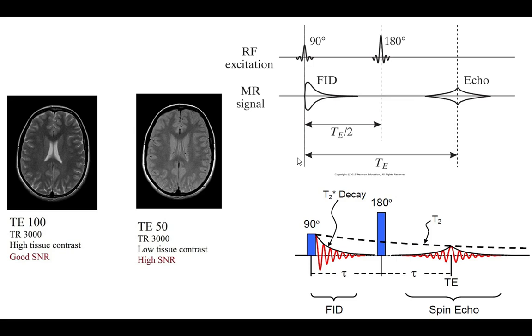What do you want? You just have to understand it's a trade-off. In general, we tend to go here, and if that signal to noise ratio isn't good enough, then you will deliberately scale it backwards. But we usually consider the spatial one as the important one.